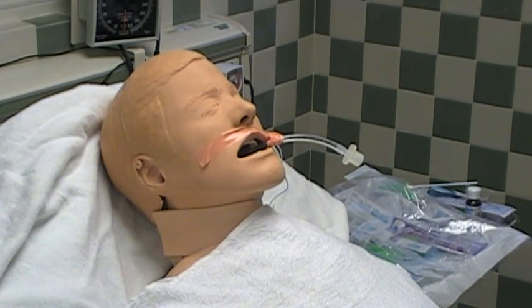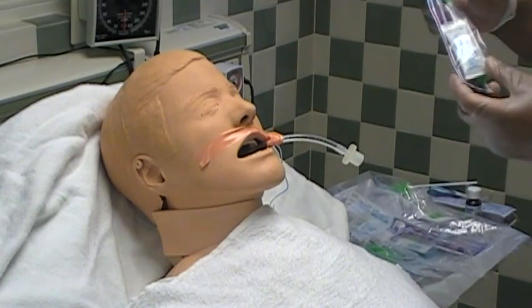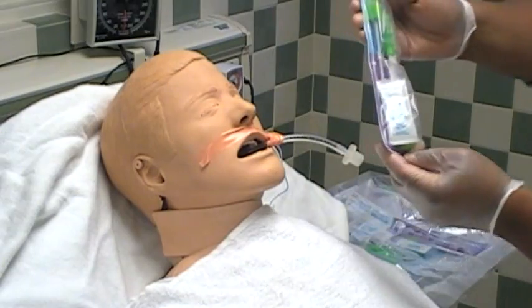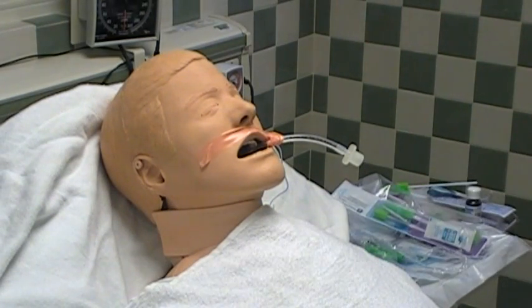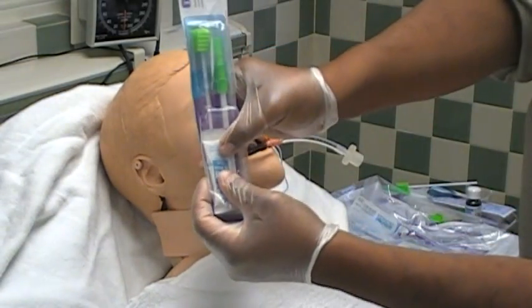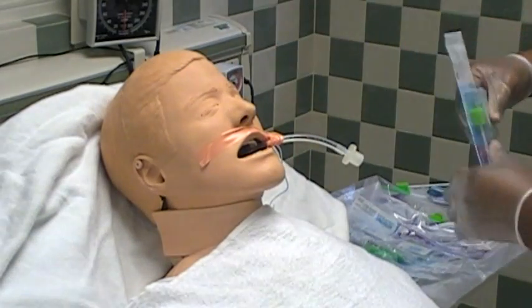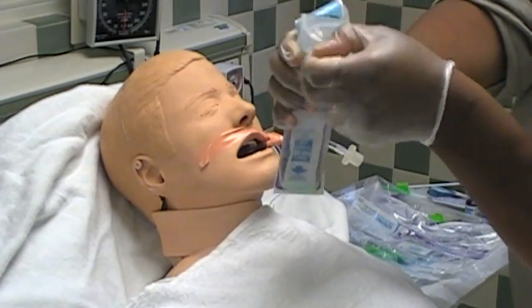For routine mouth care, which we do every two hours, use the green swab portions of the mouth care kits. We use the toothbrush portion of the mouth care kit every 12 hours. With the mouth care kit not opened yet, pop the little package inside to release the mouth cleanser. Then open the kit, and Tyrone is going to swish the green swab around in the solution.